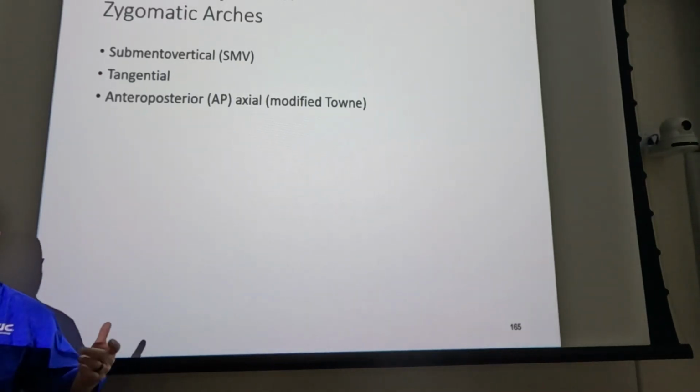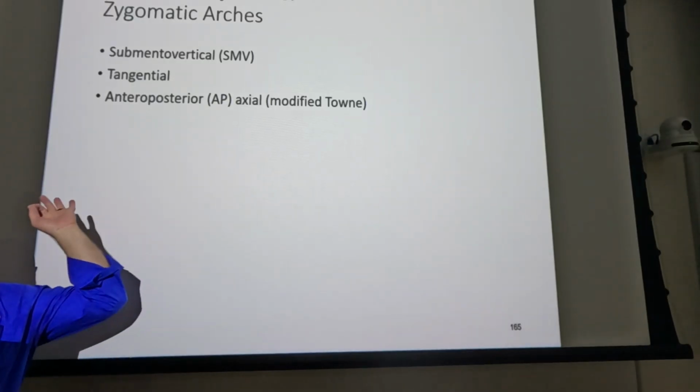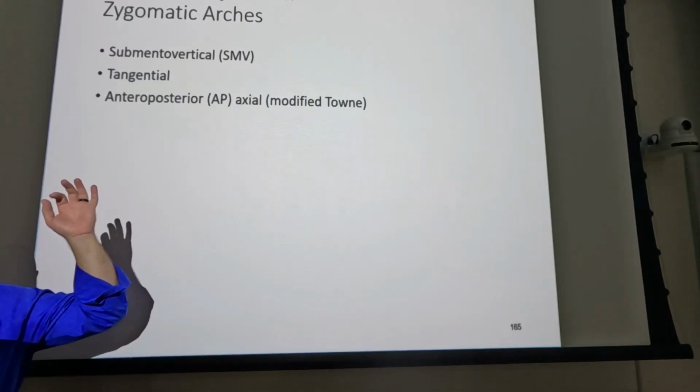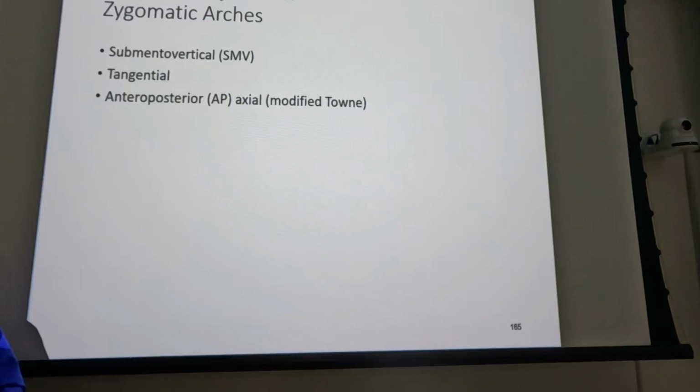All right, so you have your patient lying on the table, extend their chin as far back as possible, and they can hold the image receptor parallel to the infraorbital meatal line, and you can shoot tabletop. You don't need to see the base of the skull, so there's no need to build the patient up or anything like that.